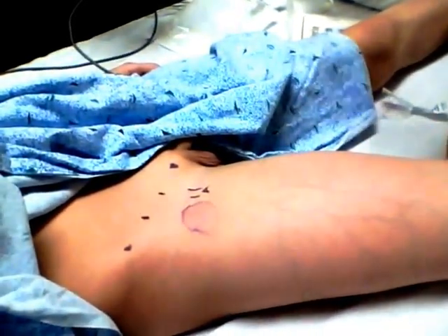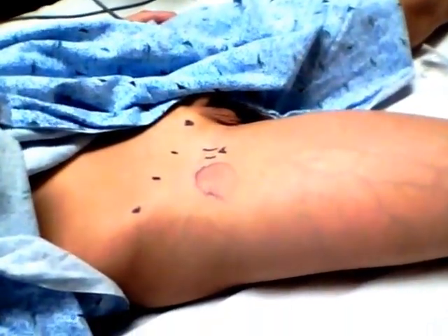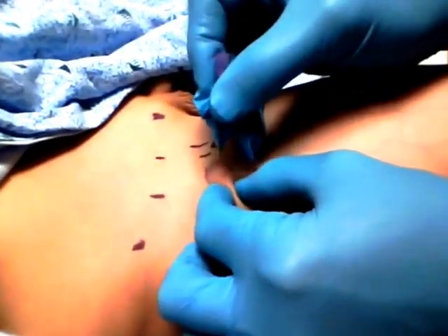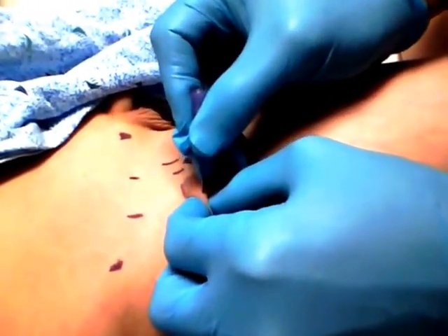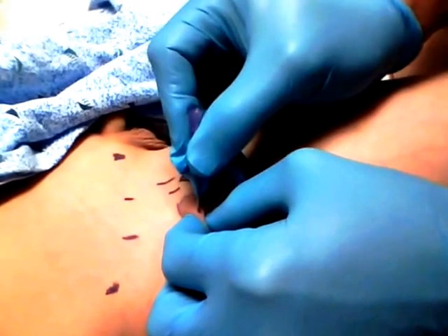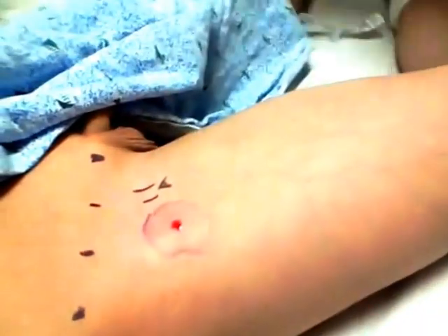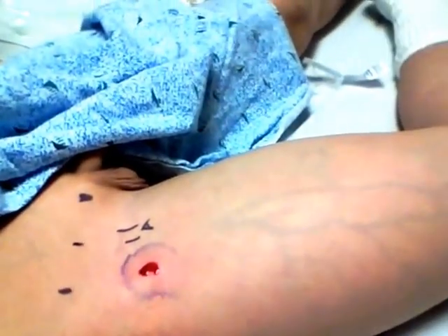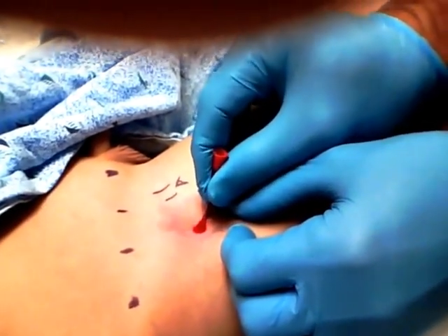The way you do this is you're looking to feel the blunt needle go through two fascial planes. First we go through the skin with a sharp needle — he should not feel this at all. I've poked a little hole in the skin, and then I'm going to use a blunt needle and we're going to feel two pops. First pop, second pop.